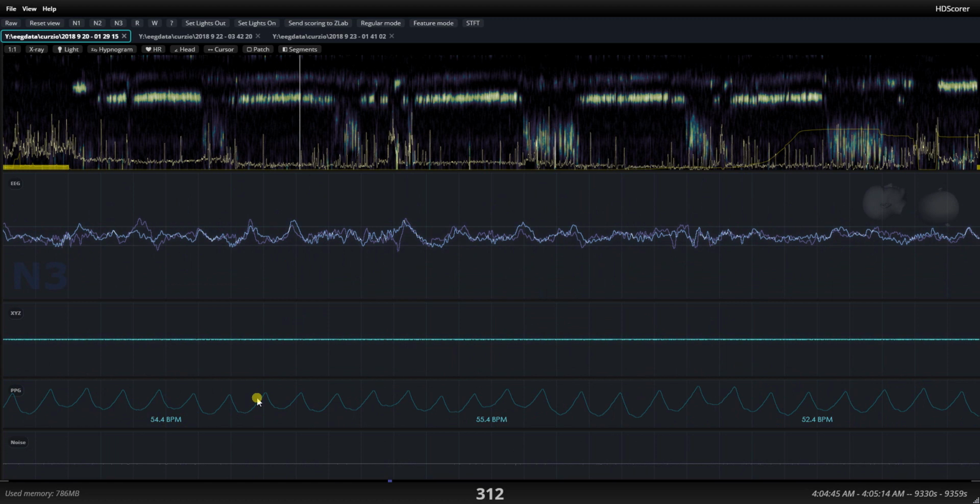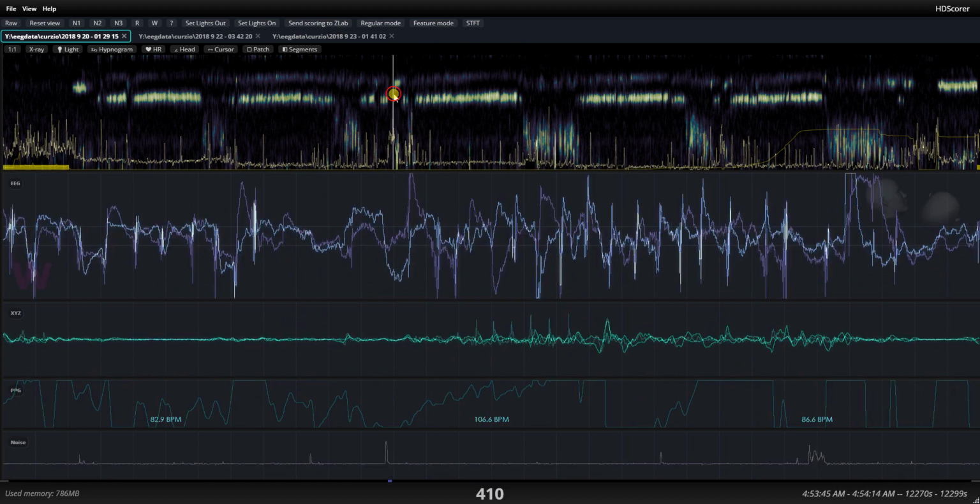Just scroll through the signal and look at the correlation between each individual peak. Here would be extremely high, and here would be near zero. So that would tell you if it's accurate or not.